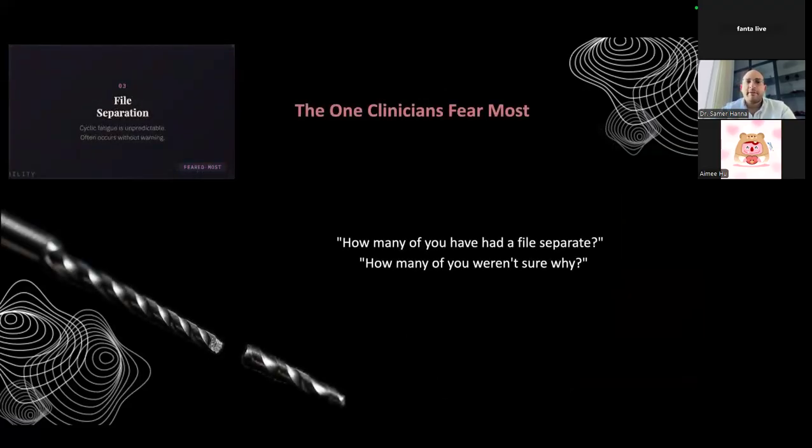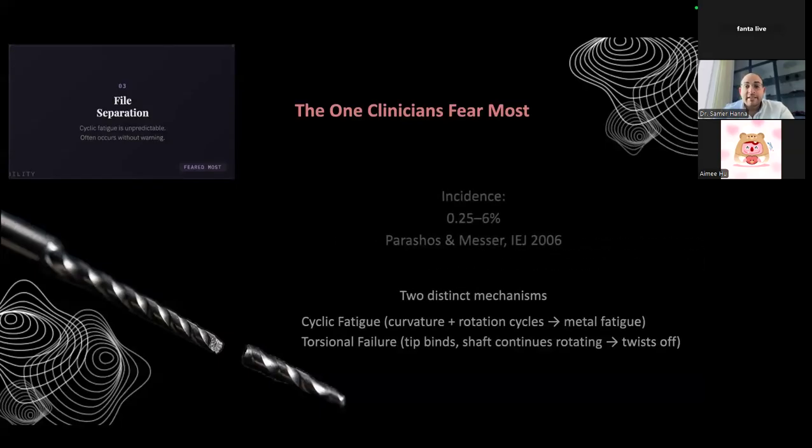And then we go to file separation, the one clinicians fear most. How many times have you had a file separate? I think all of us, if we work enough, will have a good answer for that. And how many of those times weren't we sure why? Sometimes we do everything right, having a good glide path, introducing a file in the correct way and correct sequence, and then we have a broken file. This is usually depressing, and it destroys our courage and confidence. But again, there is a way to understand it.